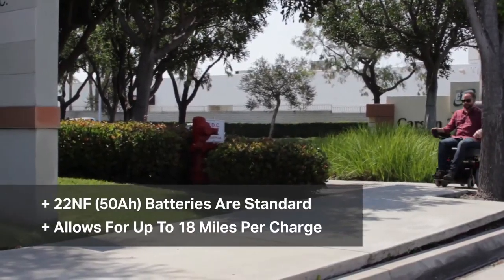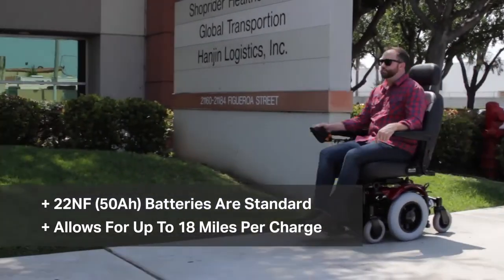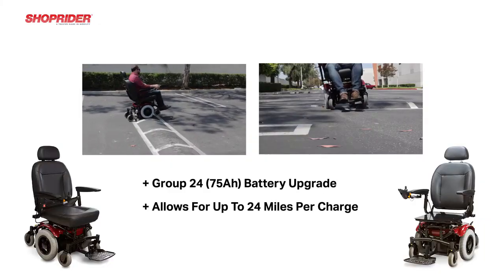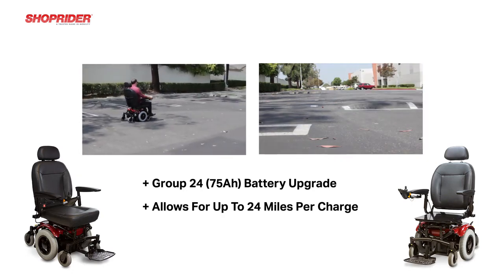Standard batteries in the 6Runner 14 are a 22NF 50 amp hour battery, allowing for a range of up to 18 miles. However, if necessary, we also offer a Group 24 as an upgrade — a 75 amp hour battery allowing ranges of up to 24 miles.